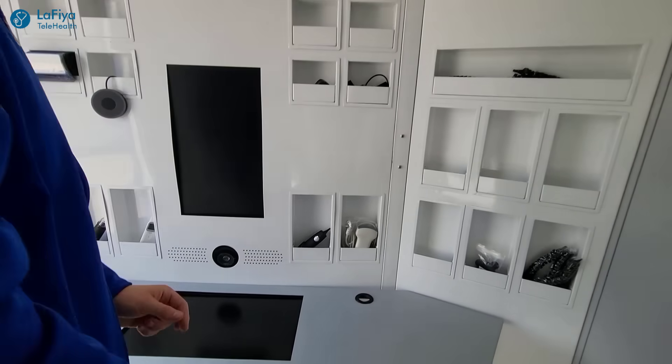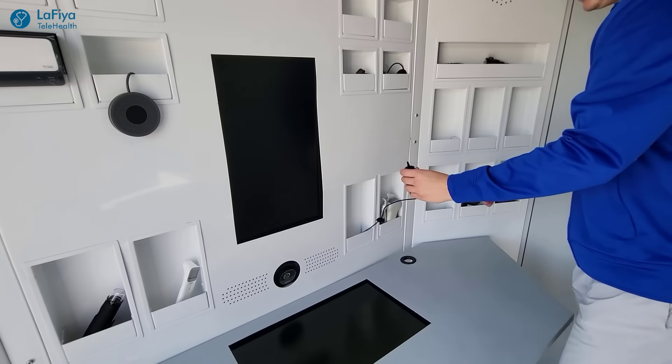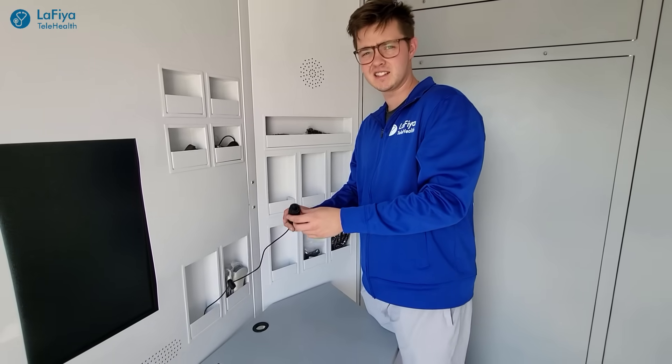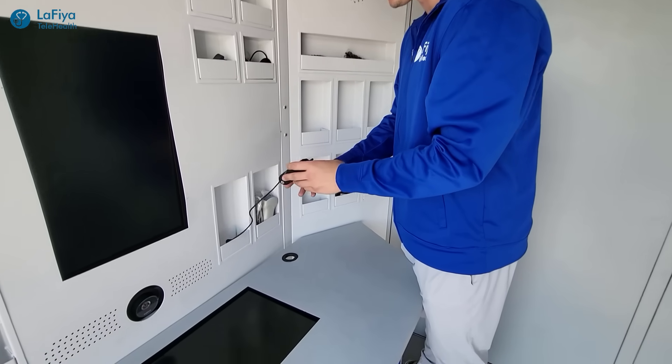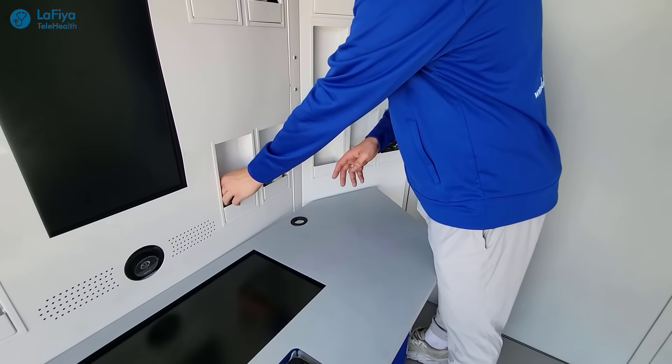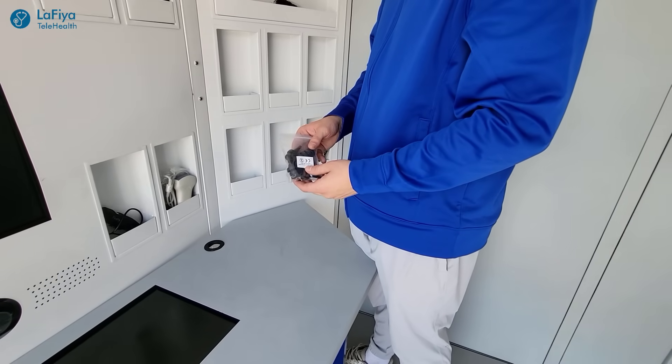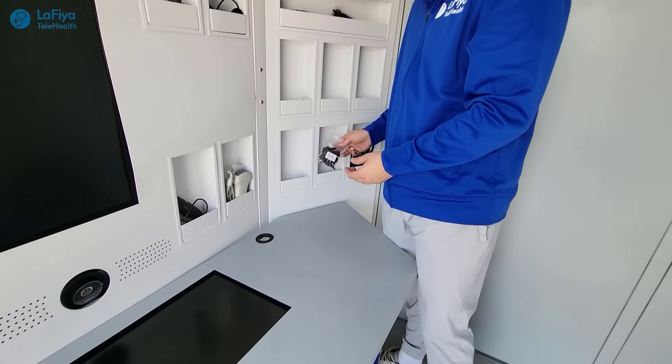Moving on over here, this is an ear camera. You stick this inside your ear and the doctor can then see inside and what's going on in your ear. It's important to note that this also comes with many disposable ear tips, so that each visit the one on top is disposed of and replaced with a new one.